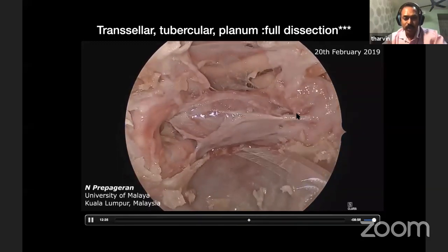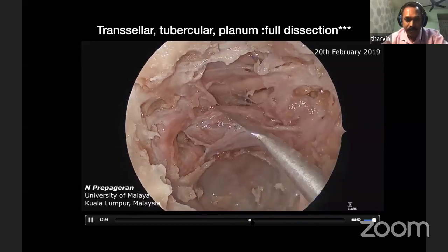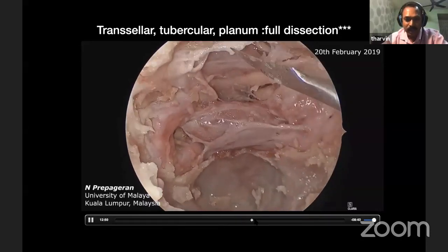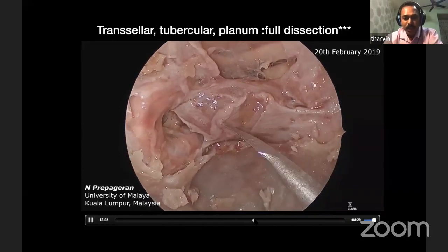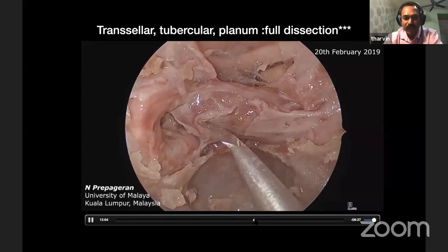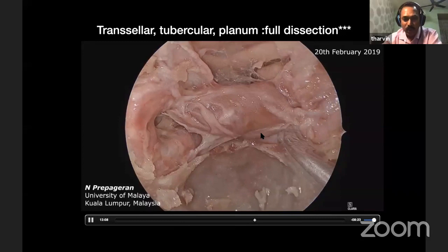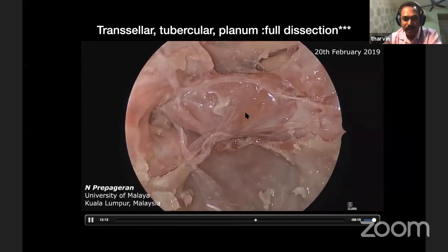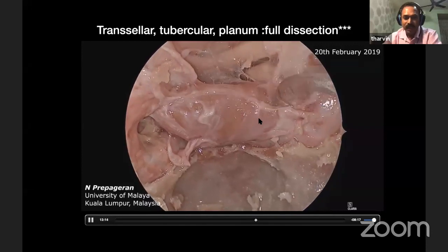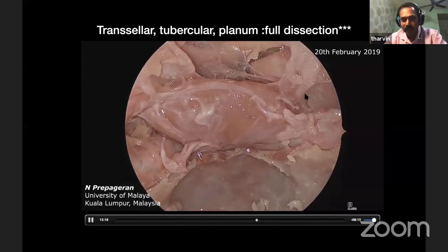The next step we want to do is we want to open up the pituitary gland. Right? So what we do is we can open up just the two duras of the pituitary gland, and then we make a cruciate incision over the pituitary gland itself, and that will expose the gland. So now we can remove the tumor of the pituitary gland and preserve the normal structures. The next dissection we want to do is to dissect between the pituitary gland and the cavernous sinus.